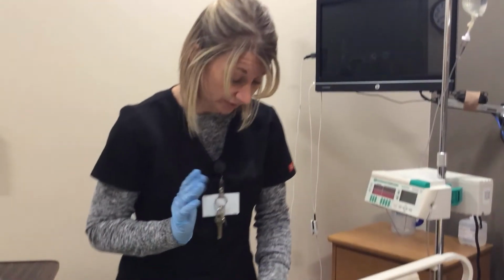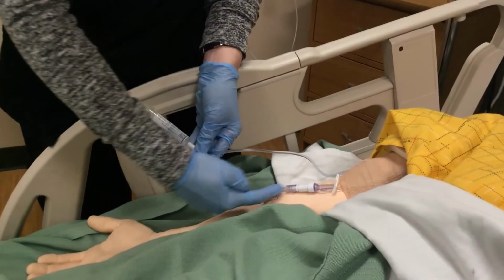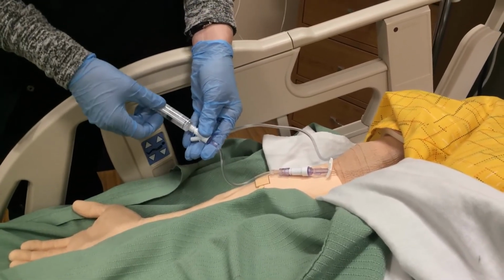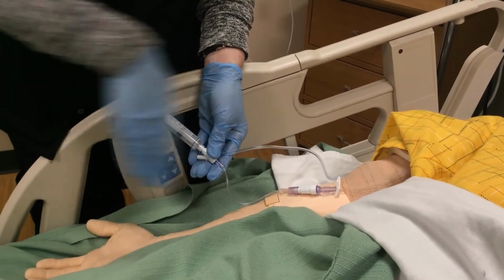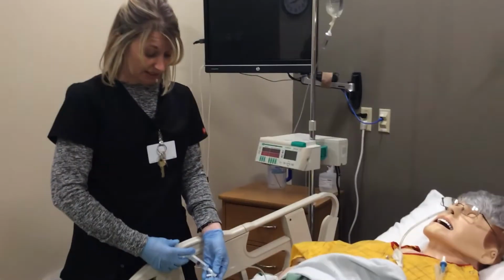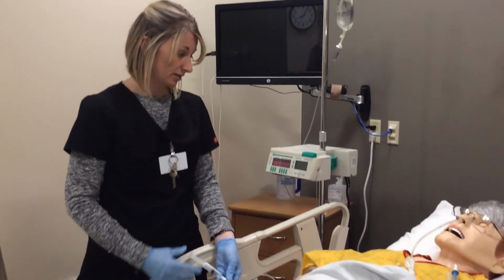You push your flush, basically, at the very same rate. Because if you think about it, a bunch of your medication is going to be still all in this line. So if you don't push your back flush at this very same rate, and you just go ahead and push it in, you're giving that medication at a much faster rate than what you should be, and you could cause harm to your patient. So again, I'm going to be watching my clock and pushing this over that 3 to 5 minutes, okay?